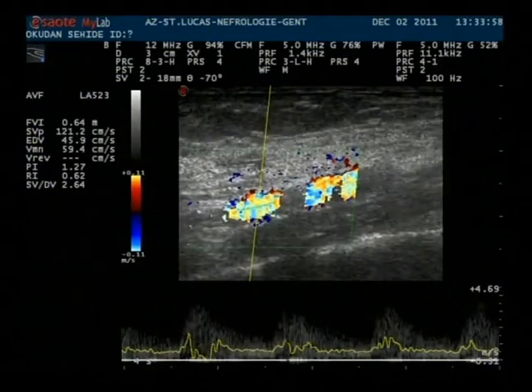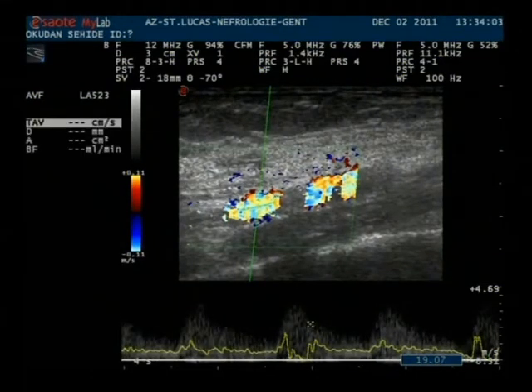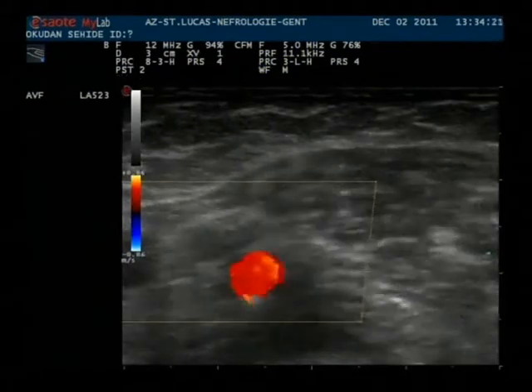The left one is the arterial one. Then we do an ultrasound and we measure the access flow in the brachial artery prior to the anastomosis. We have around 600 milliliters per minute.